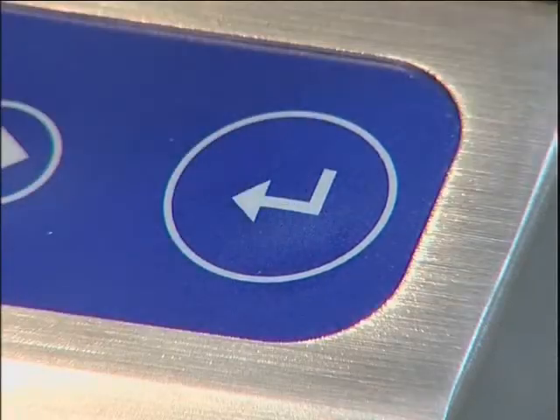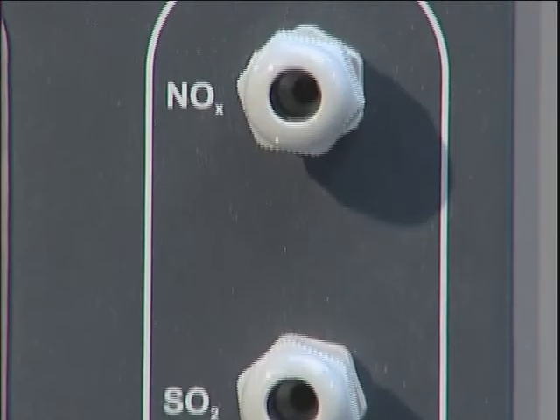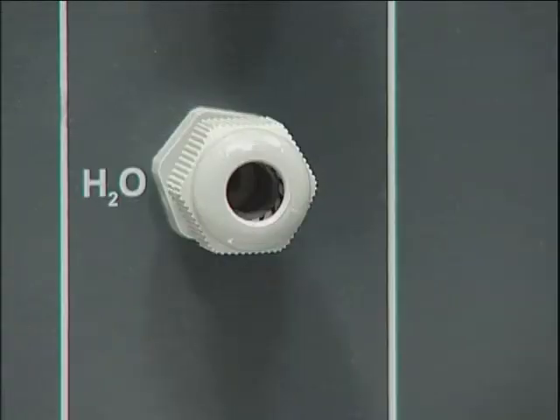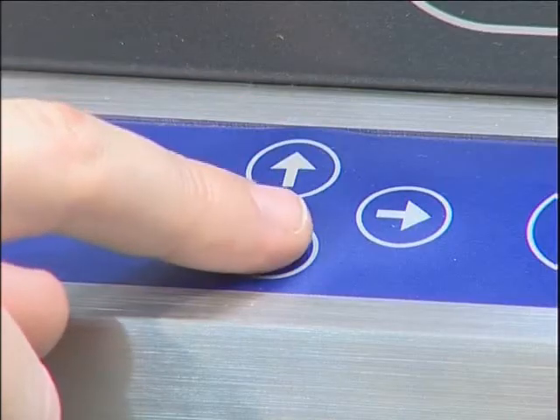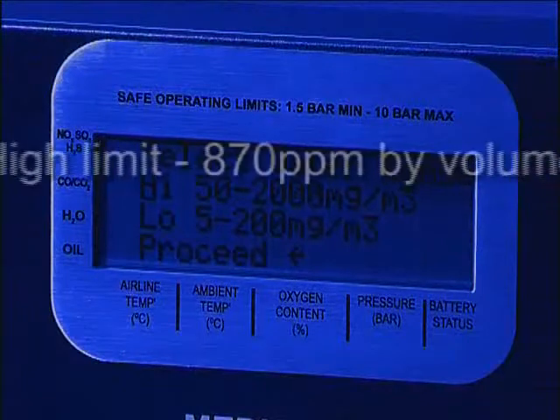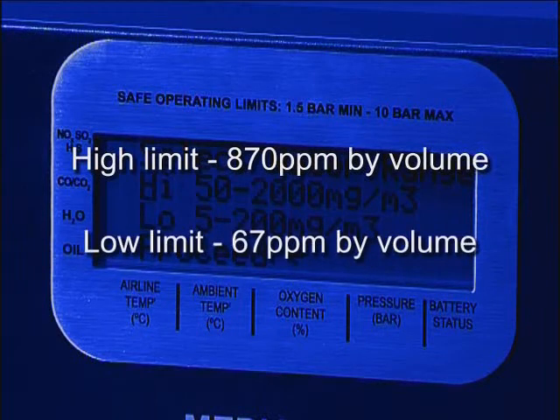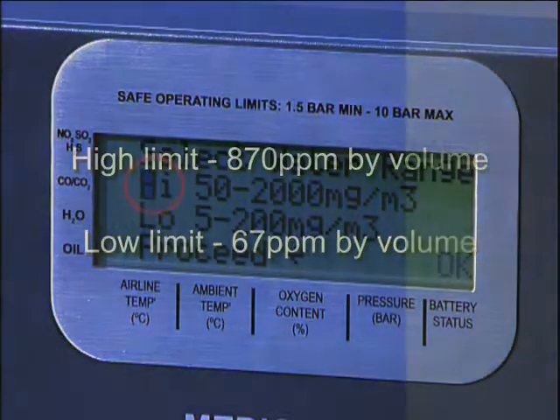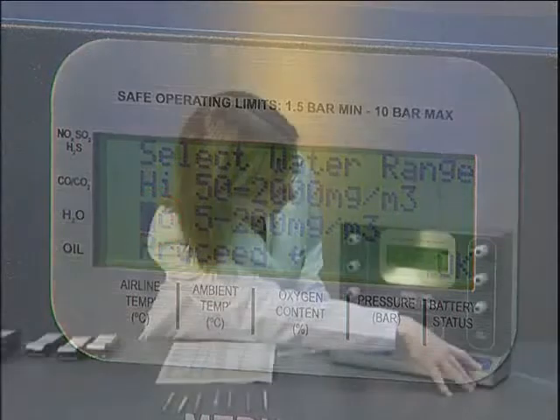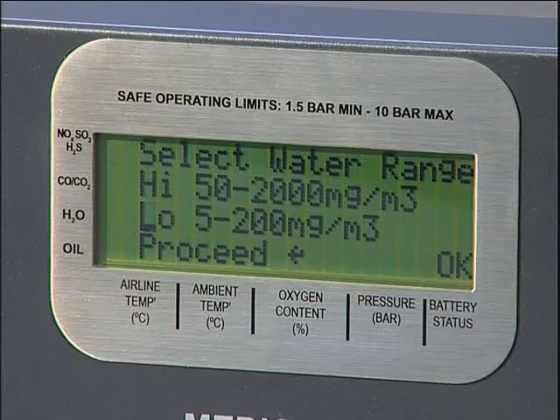Press ENTER to accept the pressure reading. All flow rates through the tube ports are set, as is the duration of flow through all channels, with the exception of the oil and water channels, which are variable and must be set using the up and down scroll buttons. There are two limits stated within European Pharmacopoeia: a high limit of 870 parts per million by volume and a lower limit of 67 parts per million by volume. The appropriate limit must be predetermined by the competent authority and accordingly the high or low range option should be selected on the F3004. In this example, the low range limit of 67 parts per million by volume is being used and so the low range option has been selected.